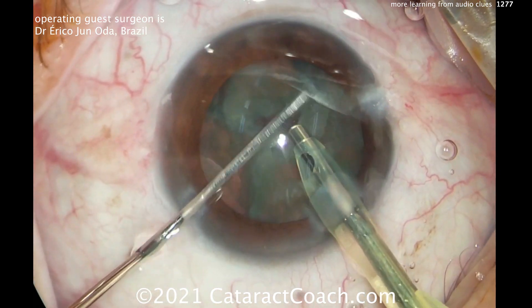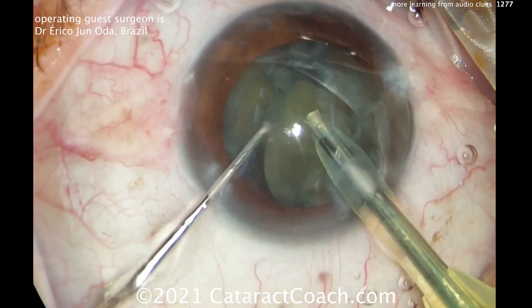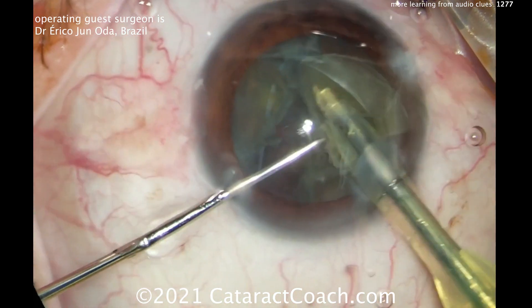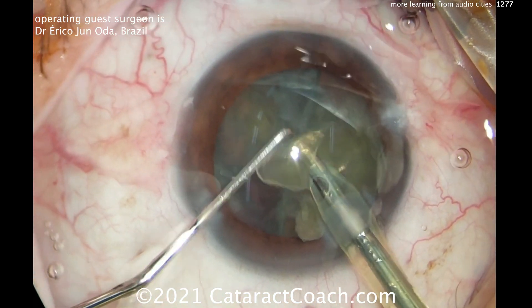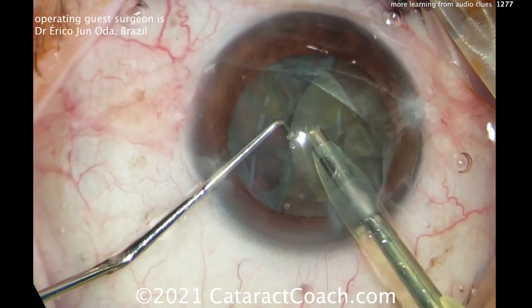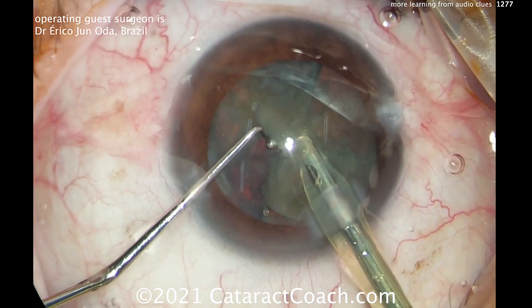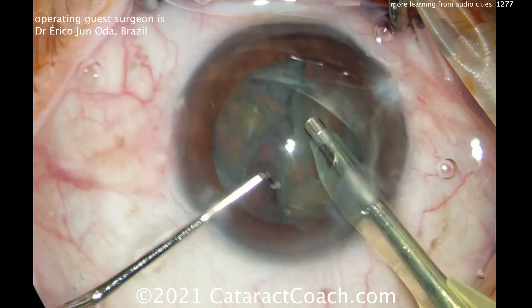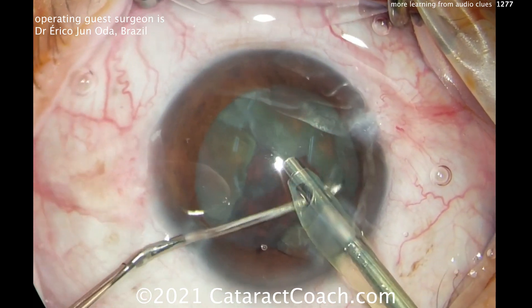So he's splitting the pieces — make sure they're fully split. That's a good move. You can hear the buzzing of the FACO too. The vacuum level is the sound of that pitch, and you can see it goes up. So he's achieving occlusion to get these pieces emulsified. On this machine, the occlusion sound will be 'eh, eh, eh' — you'll hear that too.